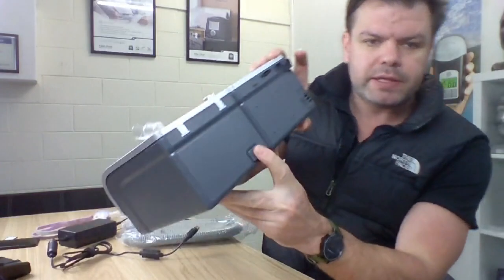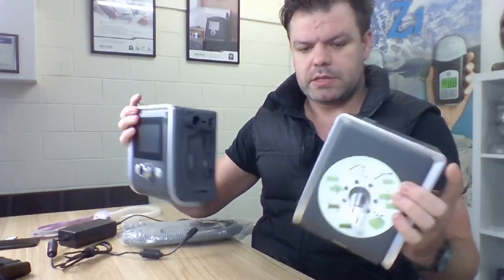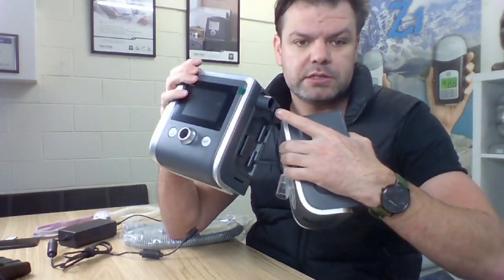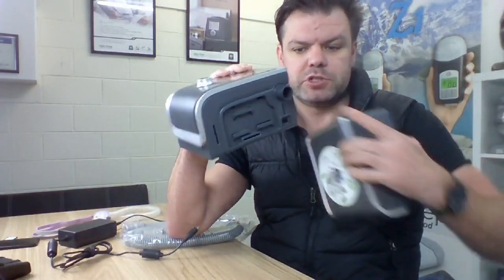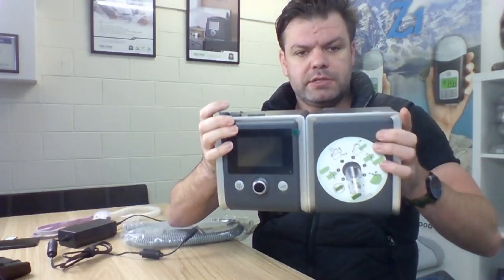To take them apart, there's a button on the back here. We just press it and the pieces come apart. So, as I was saying before, you can run this machine without the humidifier. You just attach your tubing here, okay? So just leave that part away and run it straight from your machine. But today we're going to run it with the humidifier, so just click the two pieces together, okay.